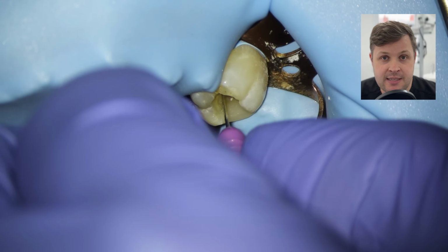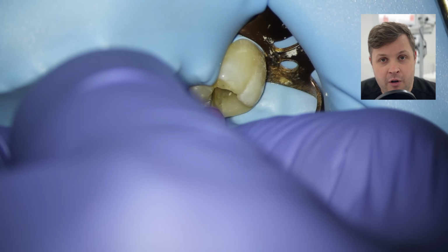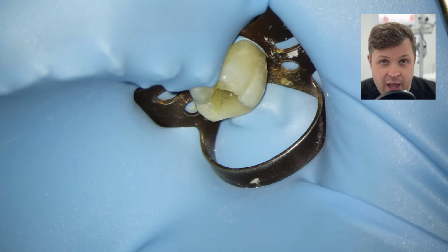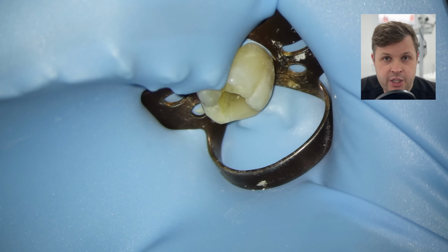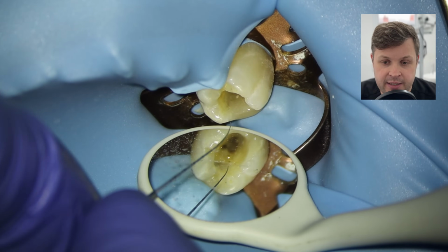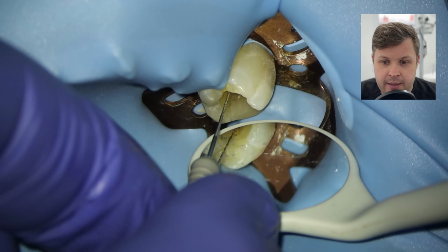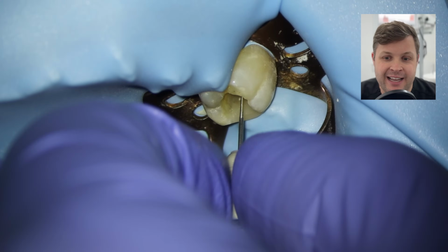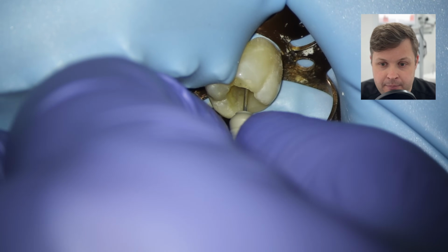We know it's patent, so we know we're pretty much on our way with that. But let's move over to the MB canal to see if we can get to a 0 reading on that, and then just check confluence at a later date. So now we're going to try and negotiate down the mesiobuccal canal. I'm going to go straight for the 8 D-finder because I knew the mesiolingual was difficult. And as soon as I place this 8 D-finder down the mesiobuccal canal, I can feel that I'm getting a little bit stuck. So maybe I'm at 0, maybe I'm not at 0.